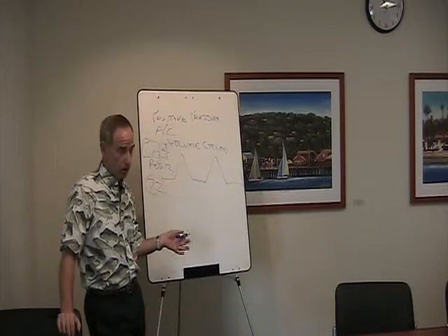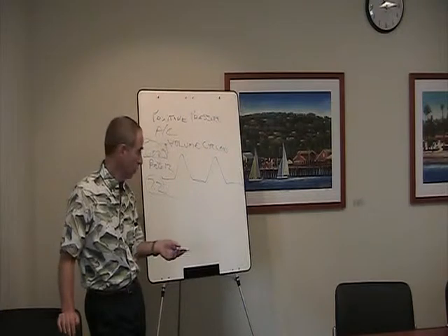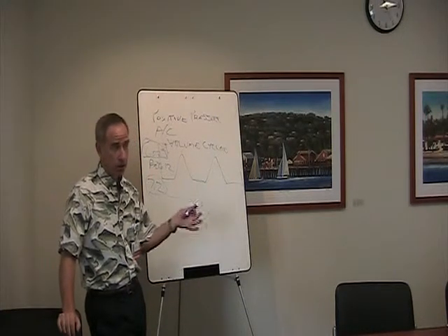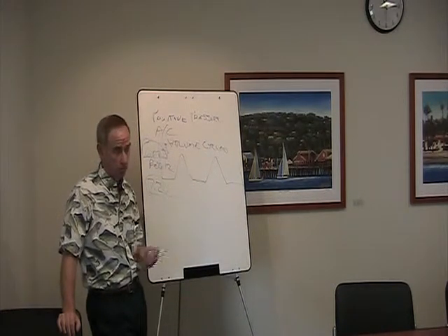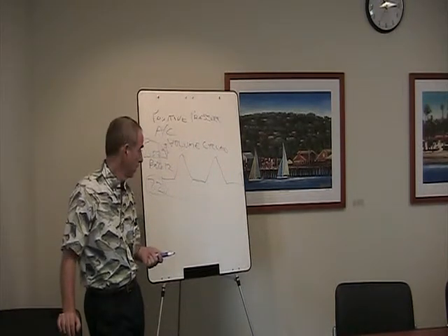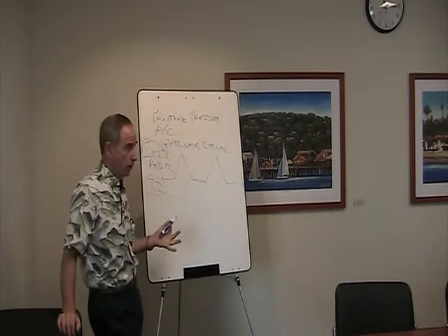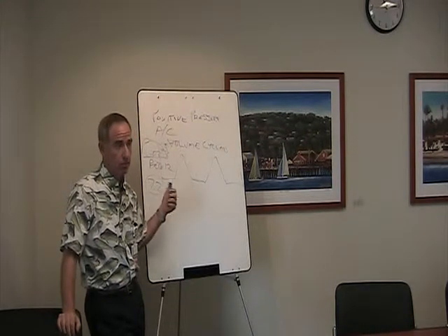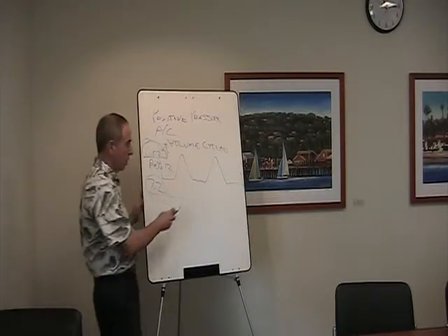If the compliance goes way down suddenly, like you go into pulmonary edema for whatever reason, and the compliance drops, the ventilator will still try to put in this 600 cc volume, but the pressure will go way up. So that's one problem with this type of ventilation, but again, we have alarms that will protect you against the barotrauma.